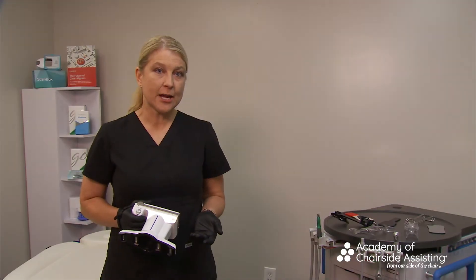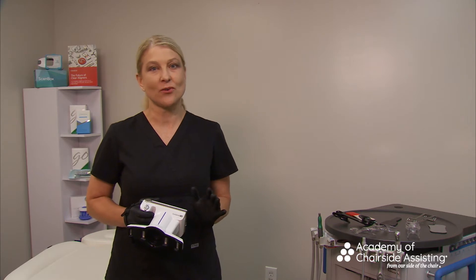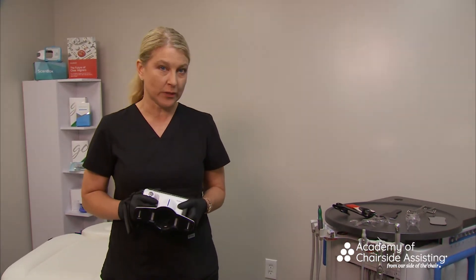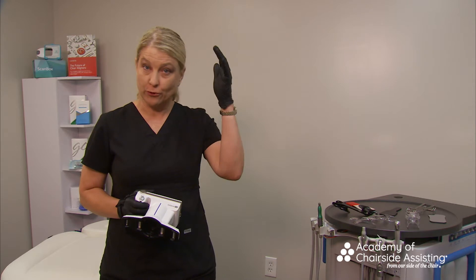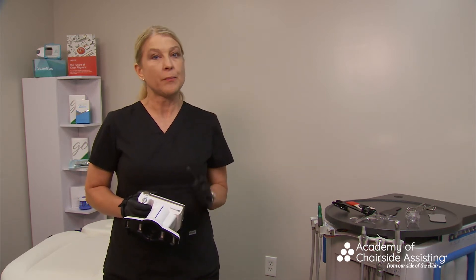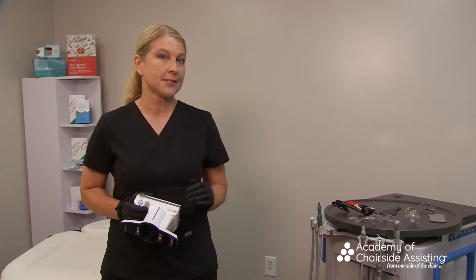Our patient is kin to me, so I don't have to worry about wearing a shield and a mask. That's important to note — ideally I would have a lab coat on, gloves, fully covered with PPE just like in a practice, but because we're videotaping I want you to be able to hear my voice and understand the process.